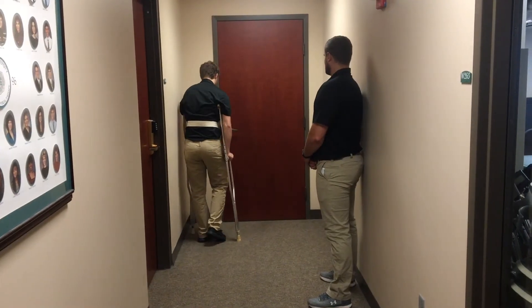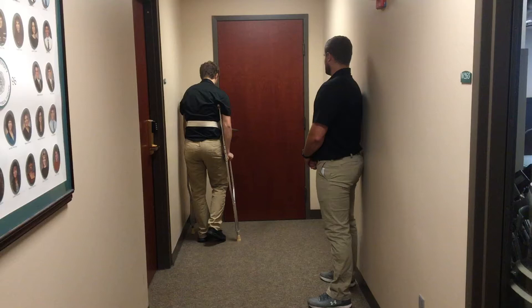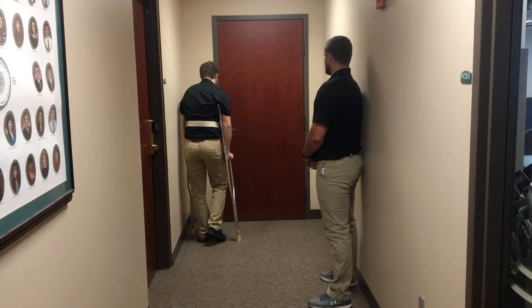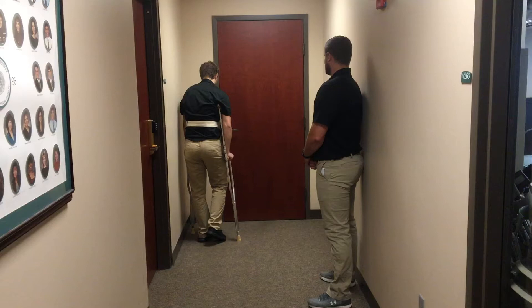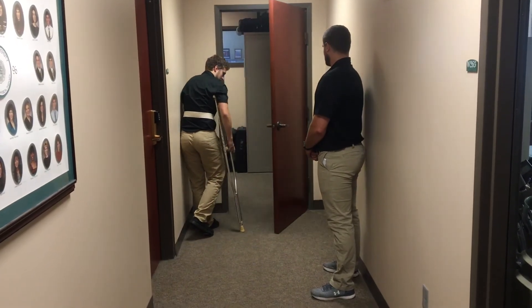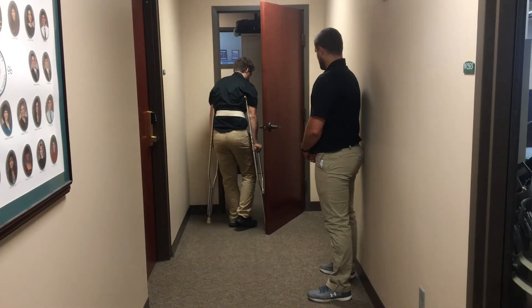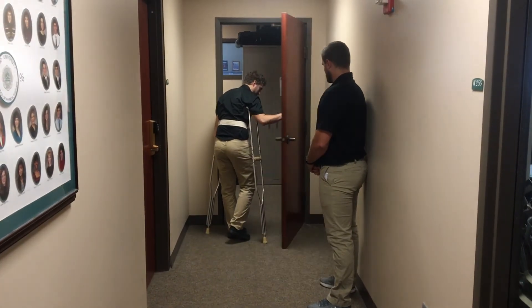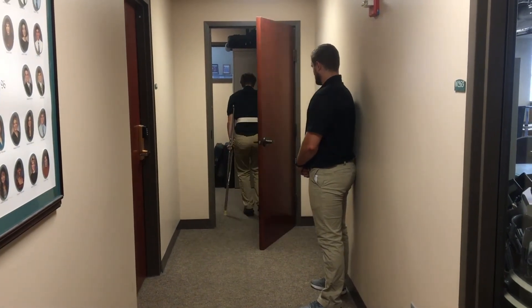Instruct the patient to approach the handle side of the door as before, outside of the swing arc of the door. The patient will shift their weight to the crutch opposite of the hand that will open the door. The patient will place their free hand on the door handle and swing the door wider than the patient and the crutches. The patient will then use the crutch closest to the door as the doorstop. Another push may be needed to adjust the doorstop closer to the hinge side of the door as the patient traverses through the door in a straight forward fashion.